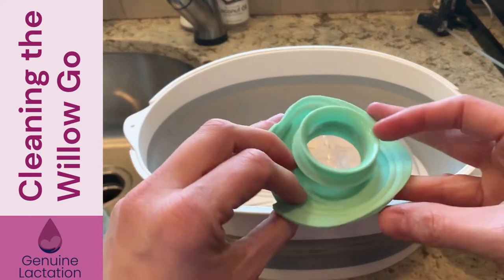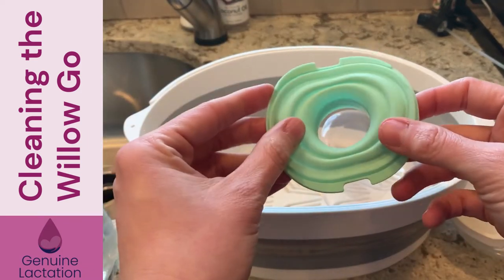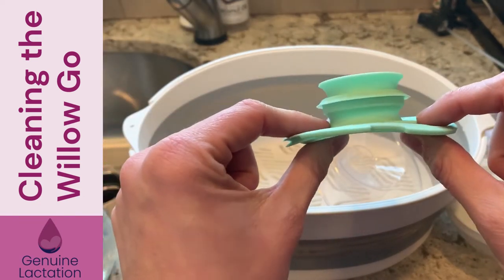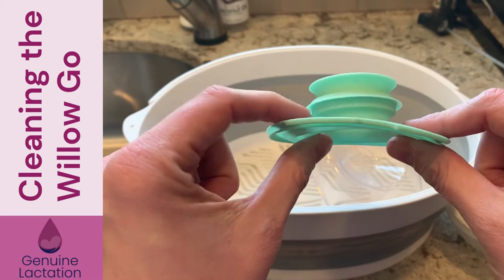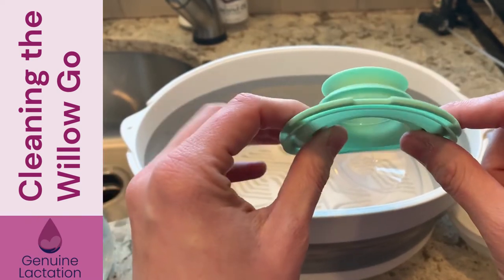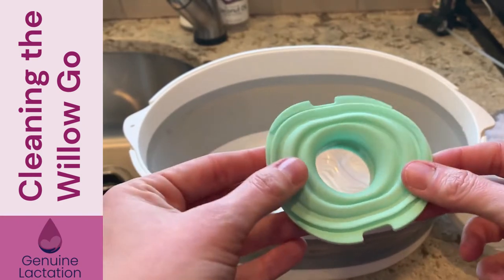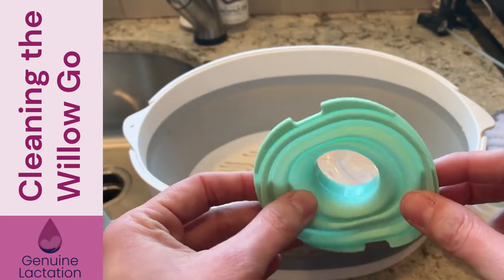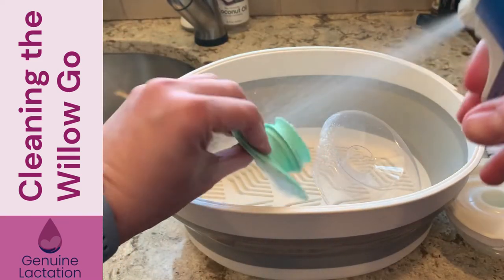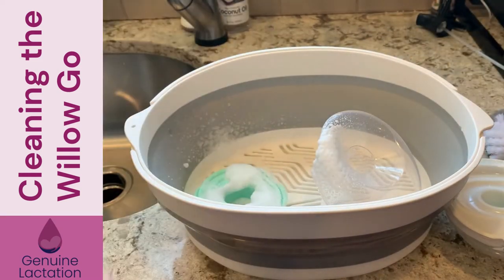This is the diaphragm — this is what actually helps generate some of the suction. This piece is the same material that the duck bill is made out of. It's also very similar to what the LV original pieces and the LV Stride are made out of. What that means is this is going to be a place that could collect milk fat if we're not careful. So take your Dawn Power Wash, spray it down, and put it in there to soak.